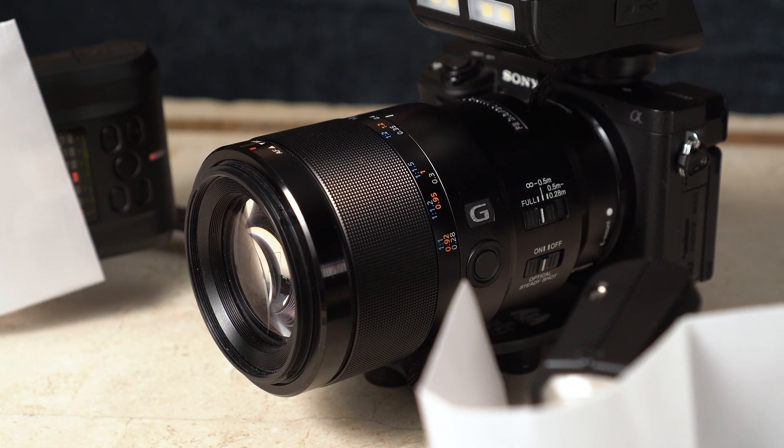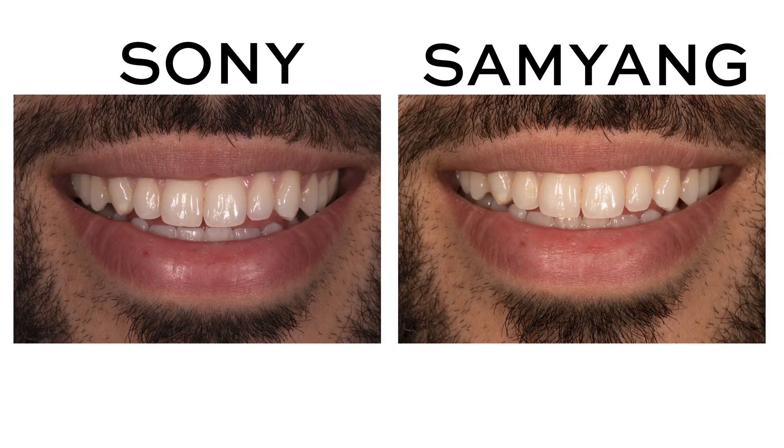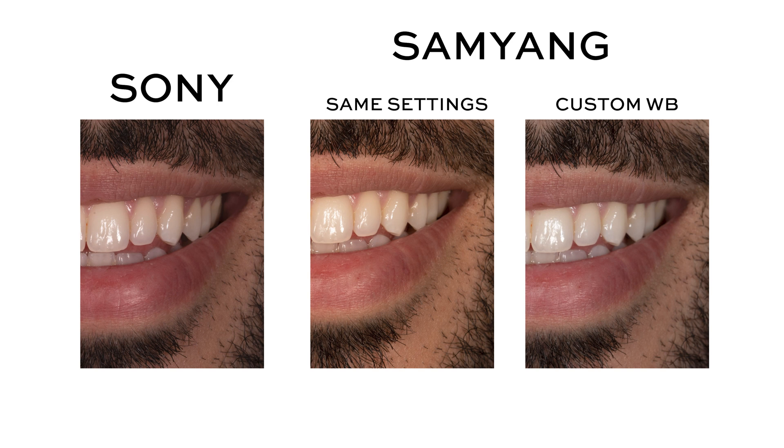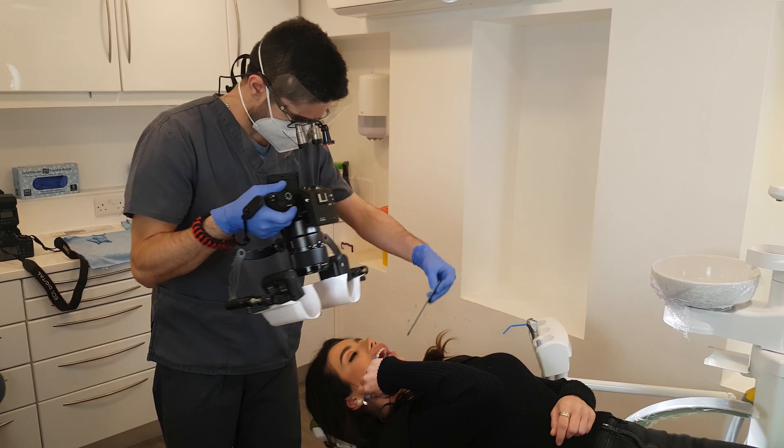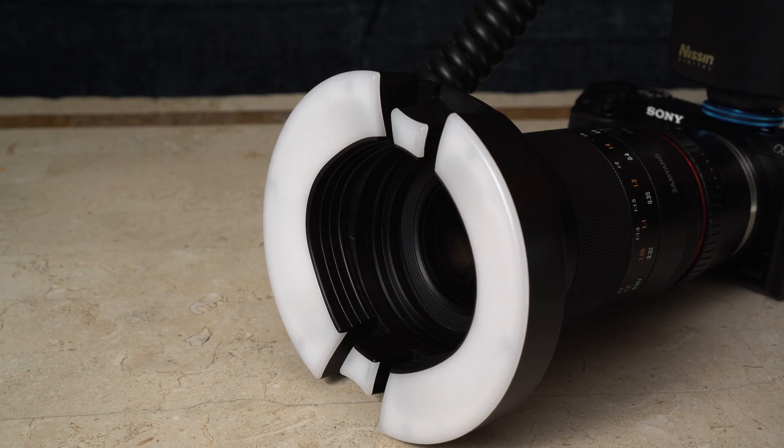The last difference is the lenses. The Sony lens has autofocus but also superior optics — colors are more accurate and look more natural. Both shots on screen were taken with the a6400 and twin flash, just with different lenses: the skin tones and colors on the Sony lens are much better. The Samyang lens tends to give a yellow hue to pictures, which can be partially corrected with a custom white balance, but the colors still aren't as good as the Sony. The extra cost may not be worth it for most people, but it allows quicker, more consistent, higher-quality photos.